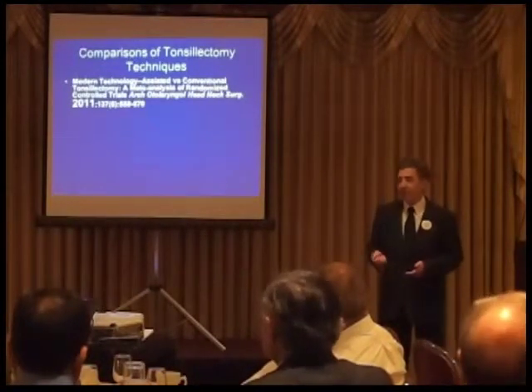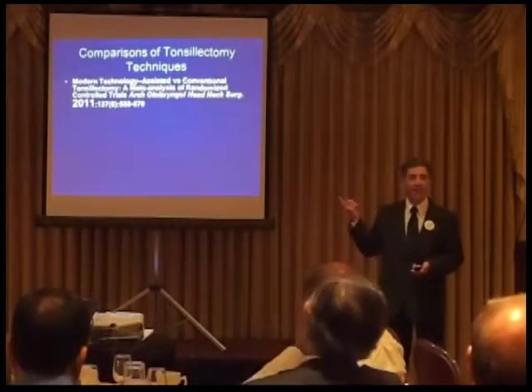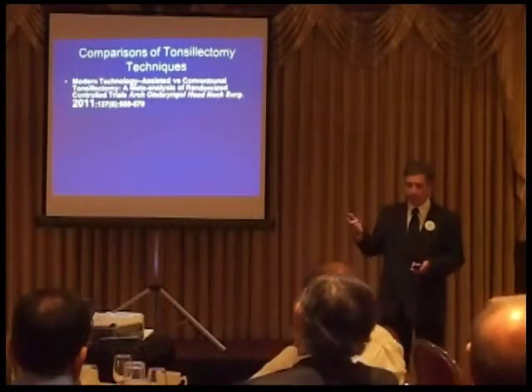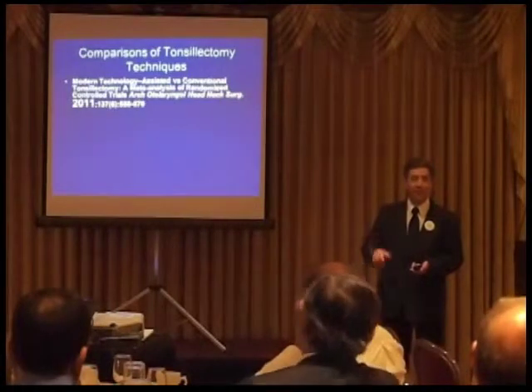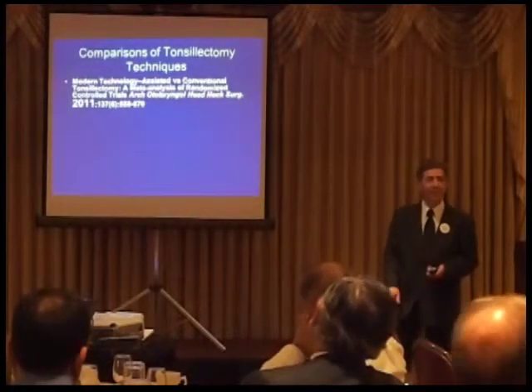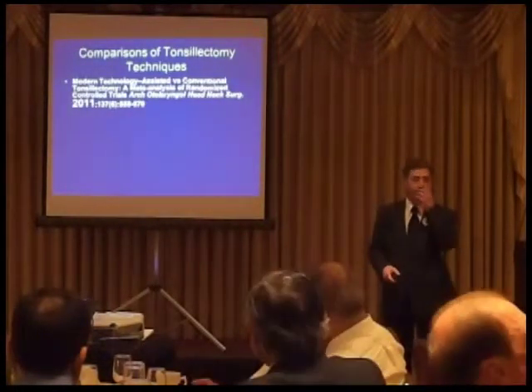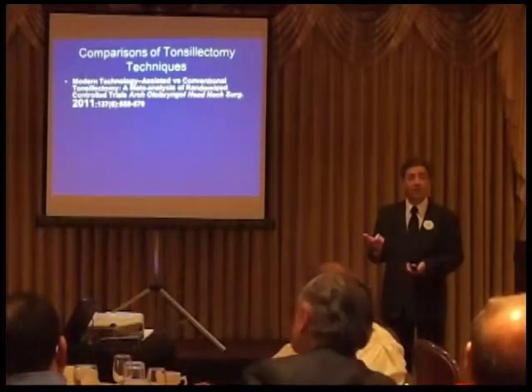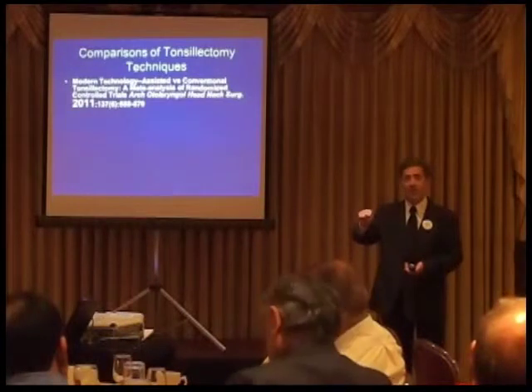And of course, they're selling you this disposable handpiece. I sort of doubt we can reuse these. Yeah, so that's where they make their money. The foot pedal is for free, but it's not a lot of electric current. It's not going through the patient. I don't know what heats the area, but whatever it is, it's not electricity going through the patient.